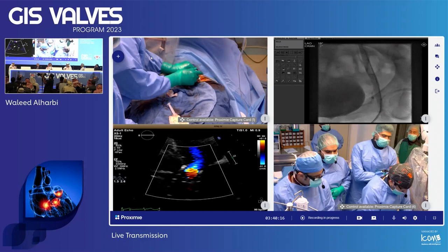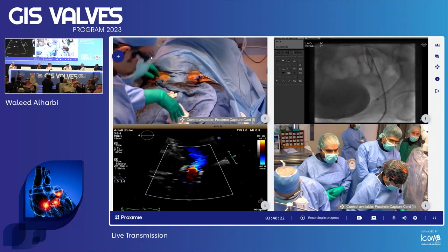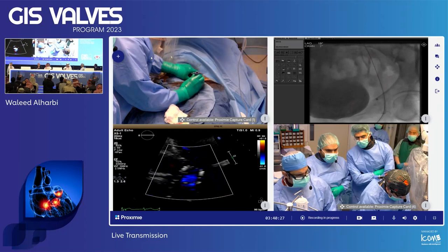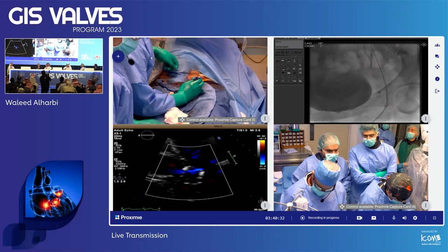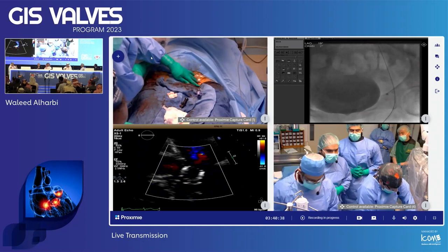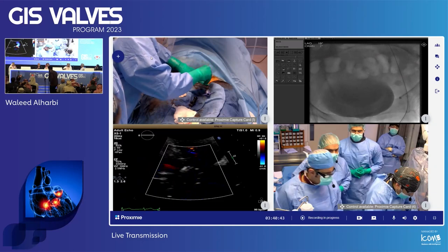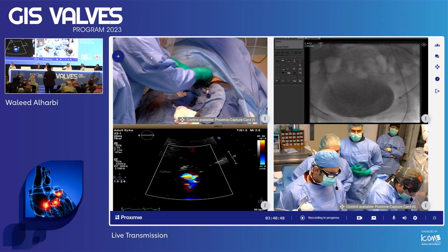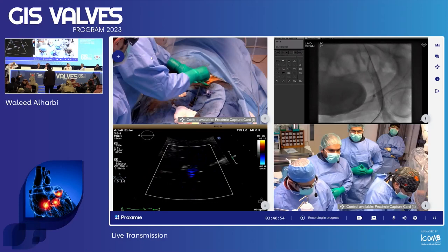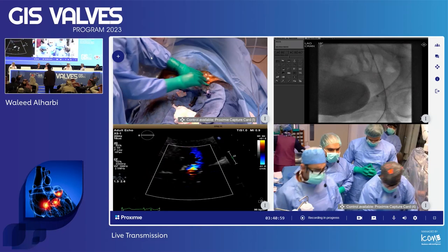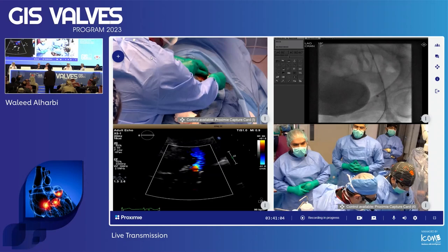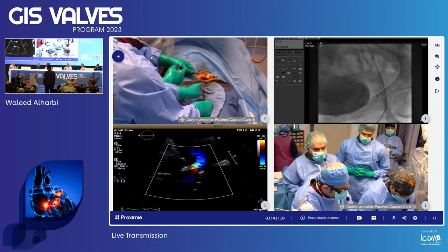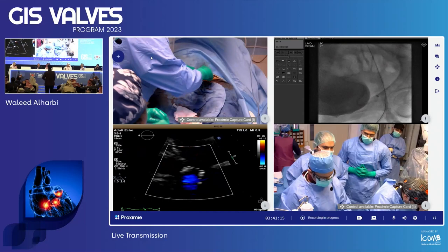We already finished the device. We don't need the echo anymore. We're closing the right side now. Samir Kapadia has a technique to ask about — how many of you use a single-side unilateral approach? For the last three to five years, we have not been using two sides. Just use the same side — one incision, close it, the patient has only one-side access. It's extremely safe, not exactly minimalist but with two sheaths from one side.